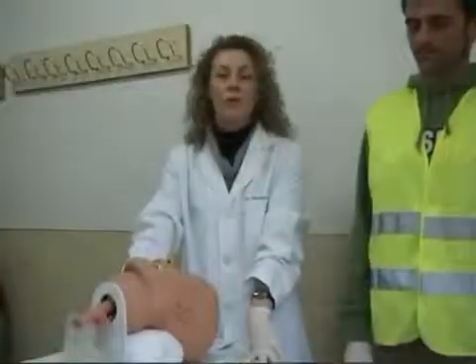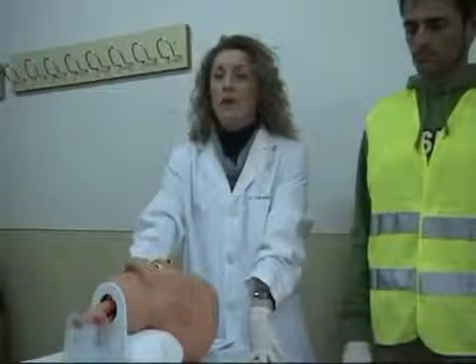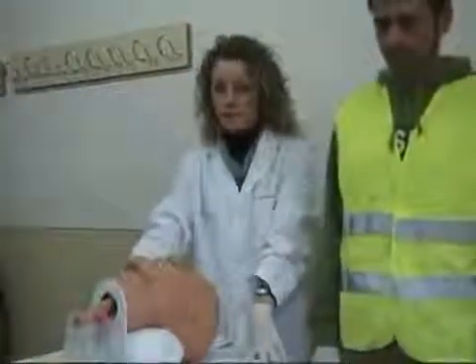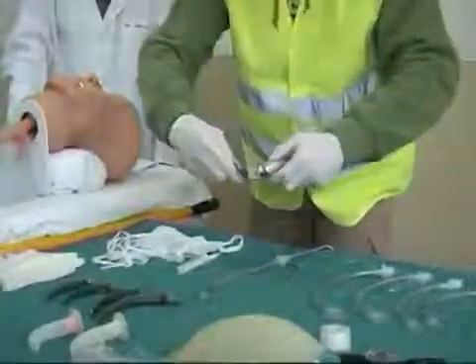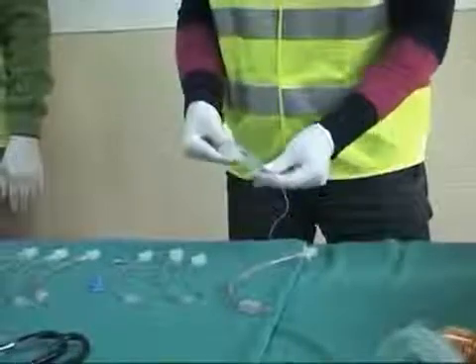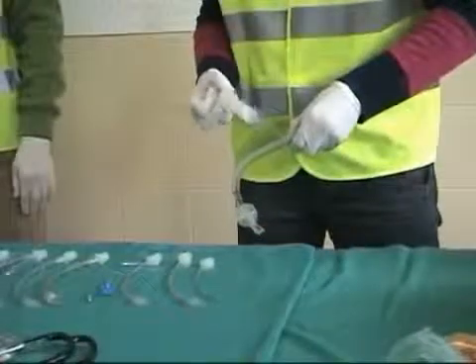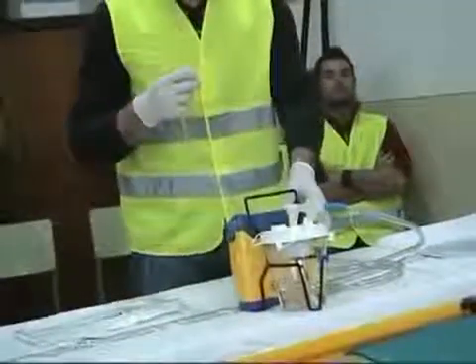After gathering the equipment, the following step is to check it. Before attempting to intubate, make sure that all the equipment is ready and functioning. This task can be performed by a trained paramedic and includes the following: place the blade on the laryngoscope handle and check the light, inflate the endotracheal balloon, searching for leaks, and make sure that the suction system is accessible and functioning.